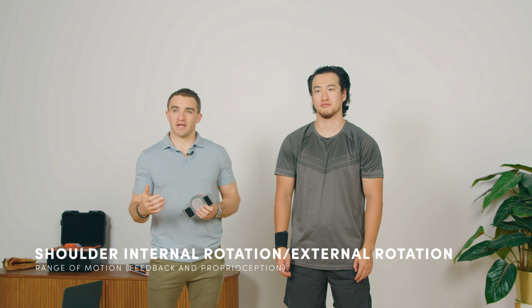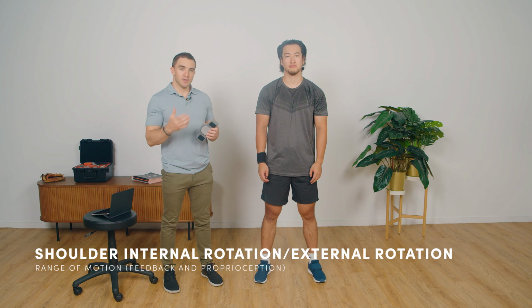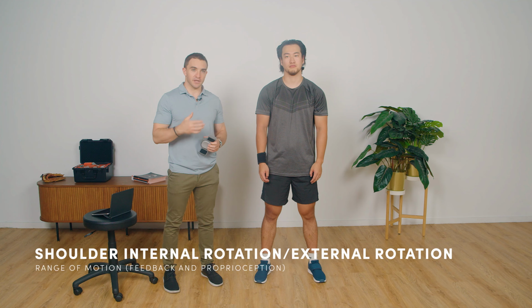Now, from a practitioner standpoint, it's fairly easy to eyeball range of motion, especially at the glenohumeral joint. But one of the reasons that we want to measure it objectively is because we want to give that feedback to our patient. For two reasons. One, if a patient's had surgery, they might have a postoperative protocol that dictates that they can only move their shoulder a certain amount of degrees. Instead of getting a goniometer out to show them, it's easy to use an inclinometer. We're going to use the Vault Dynamo for this purpose.